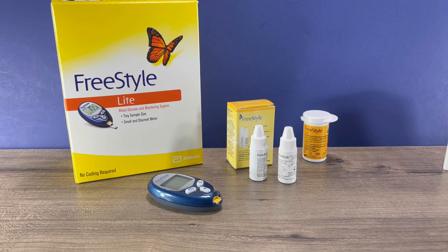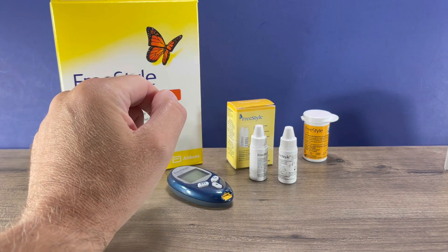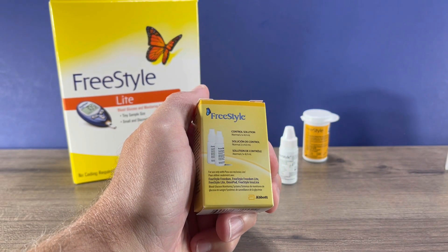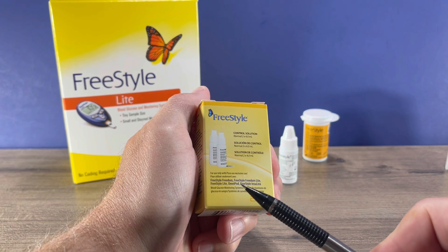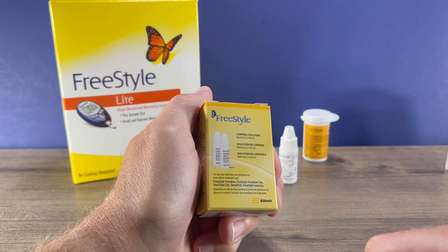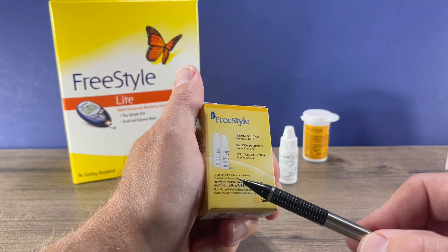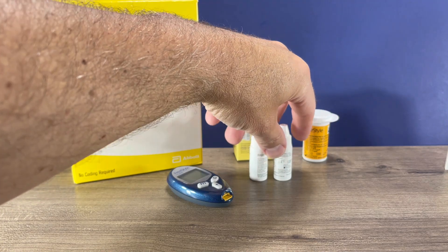Okay, let's perform a control test. To do that, you'll need the meter, control solution, as well as test strips. This is normal control solution — it contains two vials of normal control solution. You want to be certain that your meter is listed on here. This is the Freestyle Light Meter, so this control solution is compatible with this meter. Freestyle does produce different control solutions for different meters, so just check the fine print to make sure your meter is listed on there.